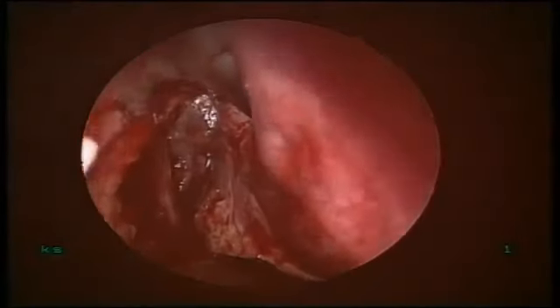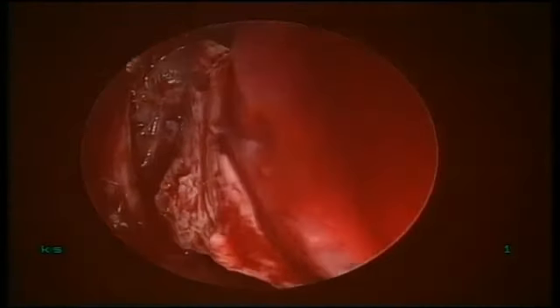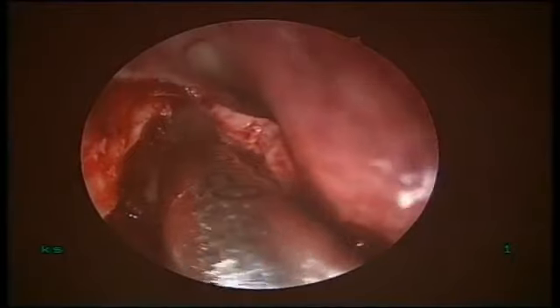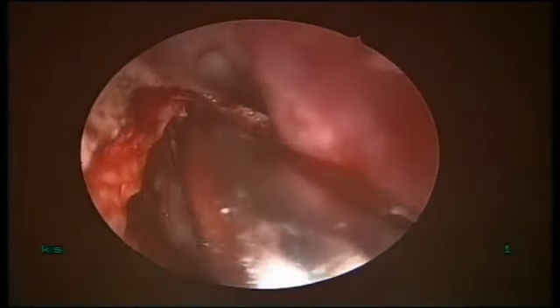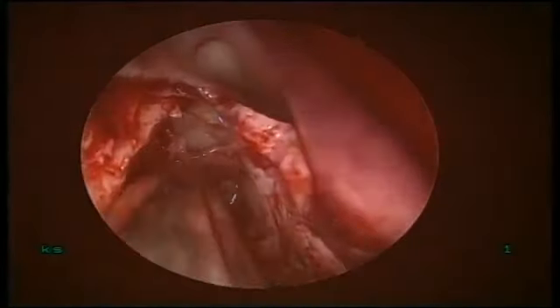See now? So now I have a full exposure of this duct as well as sac, and this is the agger which I am opening. Can you see the agger cell?